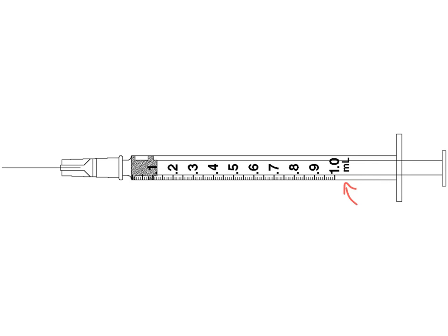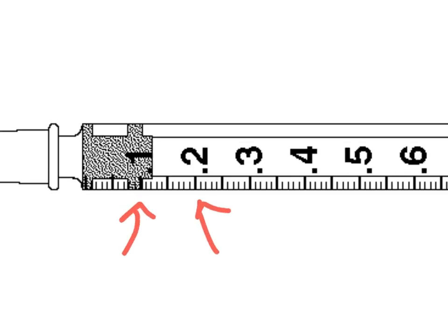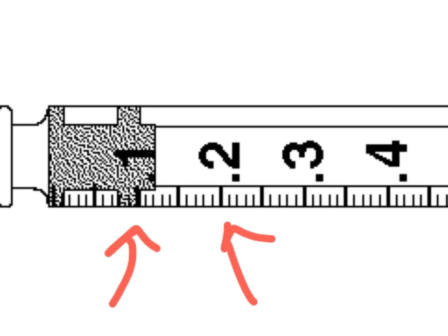So you'll notice that all the lines before that, those larger lines that are counted off for us, are 0.1, 0.2. So these are already counted off in tenths for us. That means those lines in between are actually our hundredths. So this one's going to be very similar to the 2-point decimals that we're seeing here. But you notice that here's 0.1, here's 0.2. If you were to count, let me zoom in a little bit closer there, there are 9 lines in between. So there's 4, 5, 6, 7, 8, 9. There's 9 dashes in between the 0.1 and the 0.2.